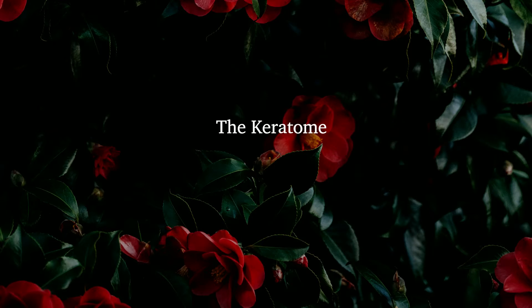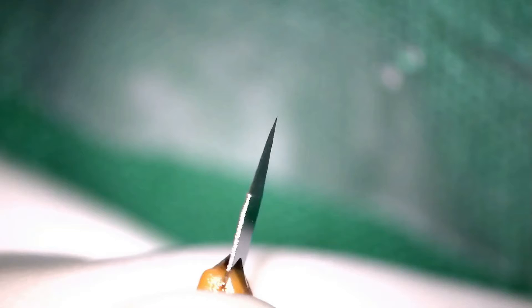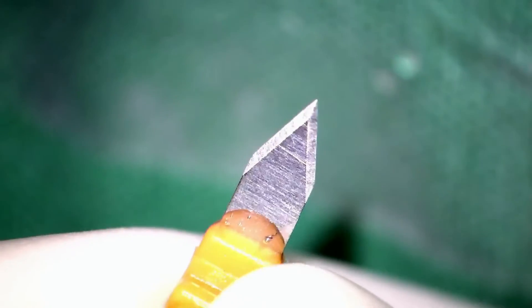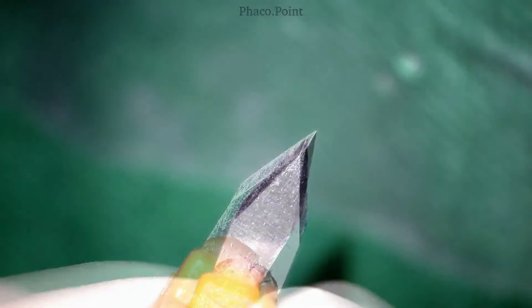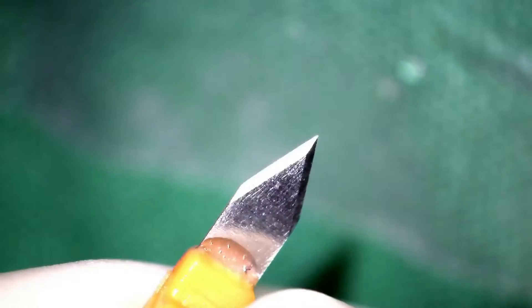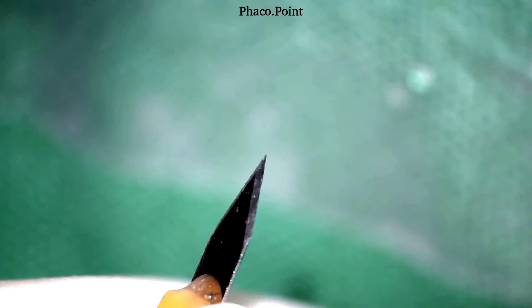Let's start with understanding the keratomes. This is a standard 2.8mm stainless steel angled disposable keratome. As you can see, it has a bevel on either side only on the anterior surface. At its shoulder — that is, at the base of the triangle that you can see — the width of this blade is 2.8mm. The tip of the blade is extremely sharp, and before we ever make our 2.8 tunnels, it's important that we check for the sharpness and the lack of any distortion of the tip prior to making the main incision.